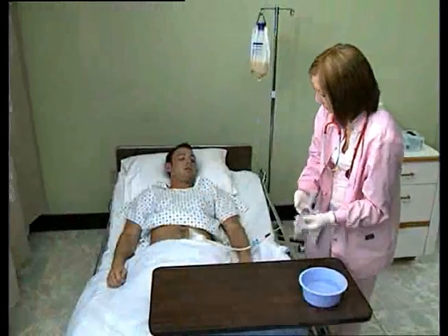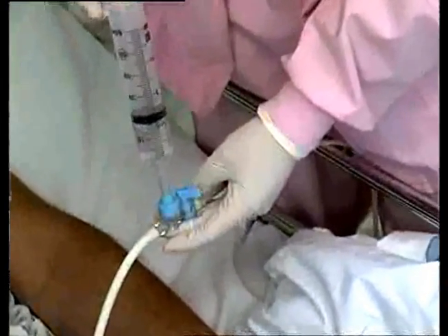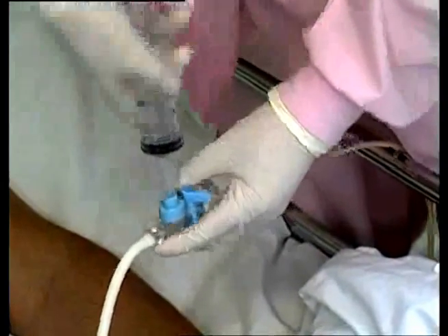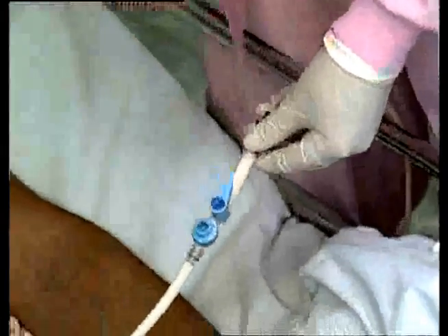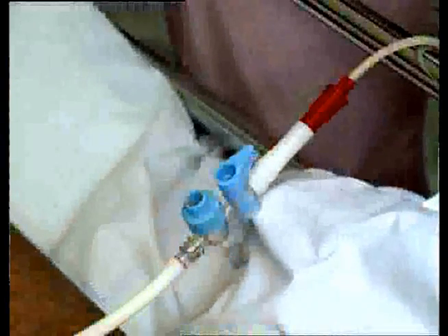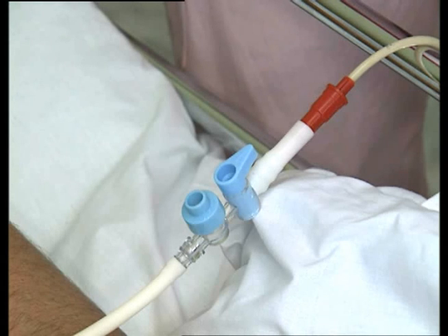Finally, flush with warm water through the auto-seal syringe port. Dale's ACE Connector is for single patient use only and is not recommended for use over 30 days. Do not expose the ACE Connector to freezing or excessively hot temperatures.